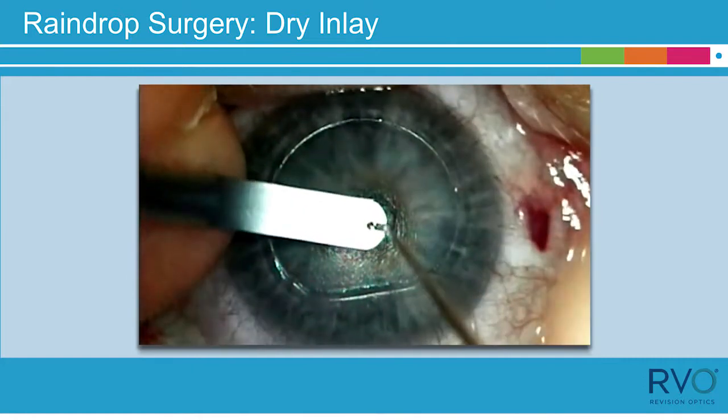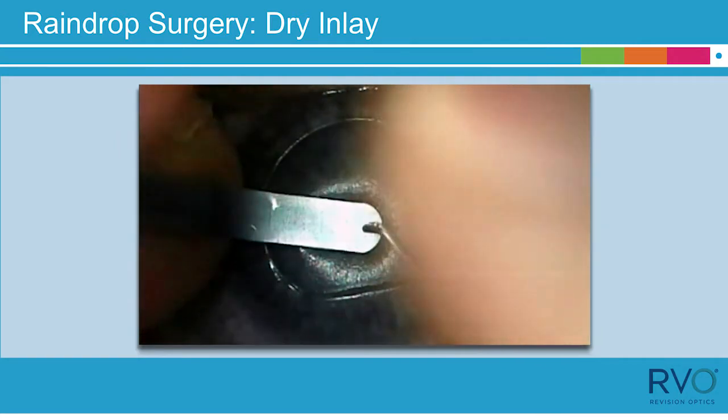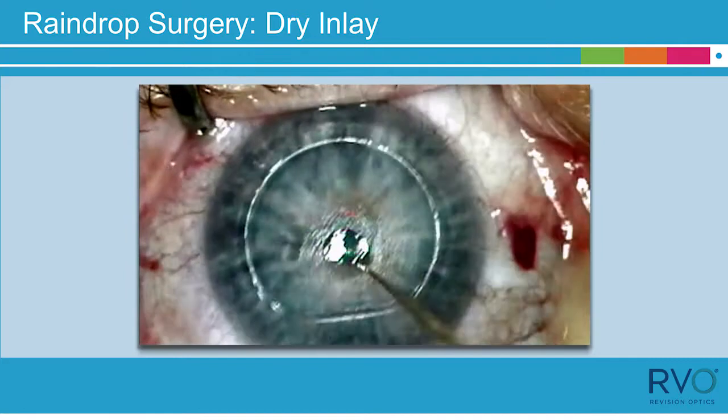Prepare a second raindrop inserter and try delivery again. Using the second inserter, the raindrop inlay was successfully delivered onto the stromal bed.